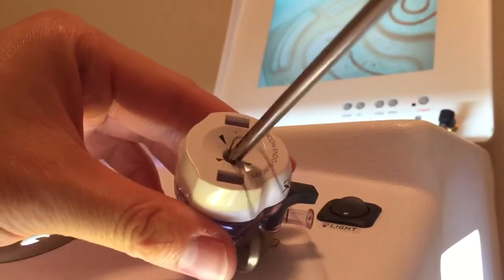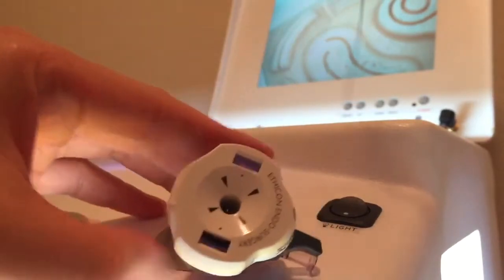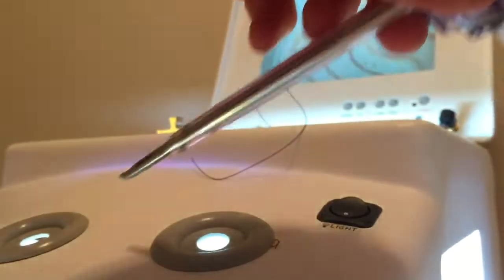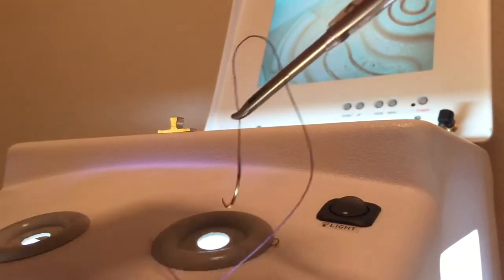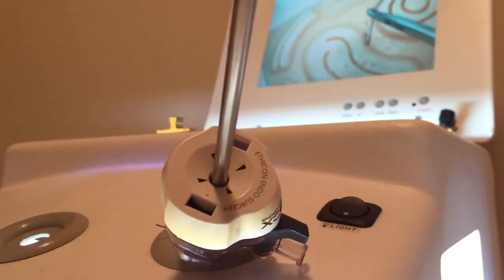When working with a 5mm port, you won't be able to directly insert the CT1 needle into the abdomen. You will need to first insert the instrument through the trocar, then grasp the suture and guide the needle into the abdomen. This is called backloading the needle.